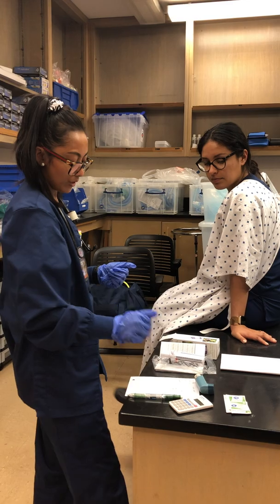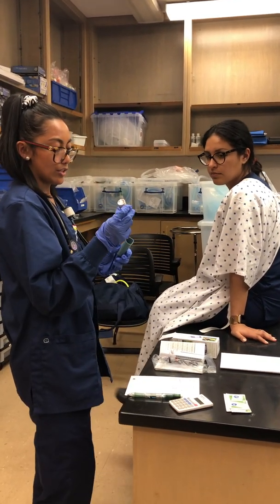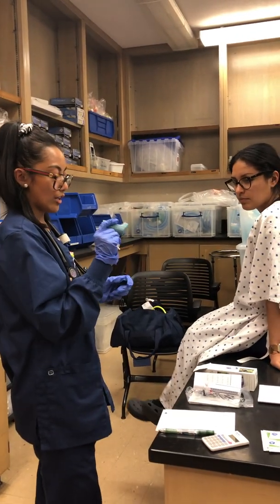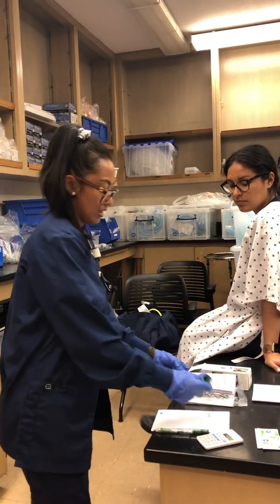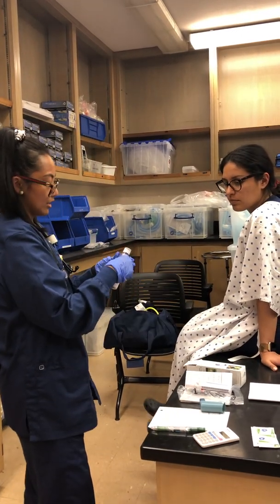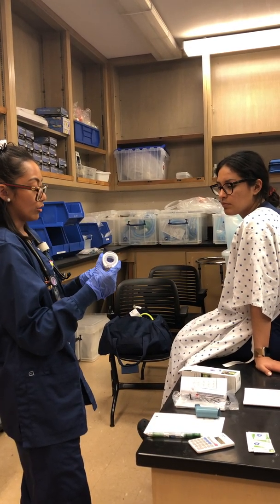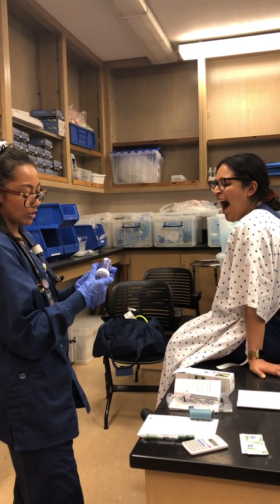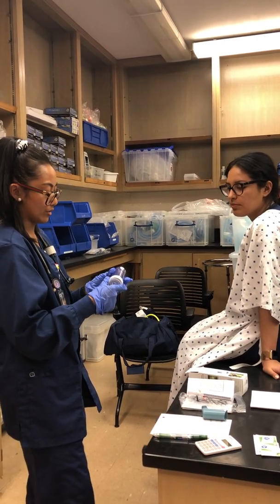Okay, so when using the metered dose inhaler, this is your canister of albuterol. We'll put this in our hand for now to warm it up. And then this is your actuator to help deliver the medication, and your cap. And then we also have your spacer or chamber, which is this. It is a one-way valve, so it only works when you inhale in. If you inhale too hard, then there will be a little musical note that will play. So when using this, we would just attach the inhaler and then I'll show you everything else about it.